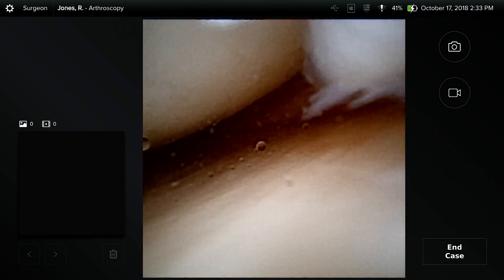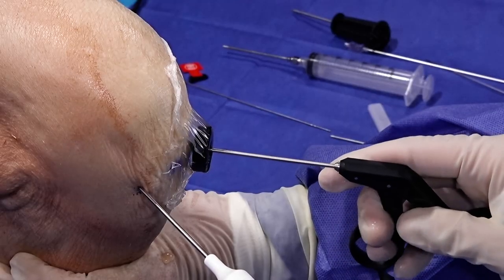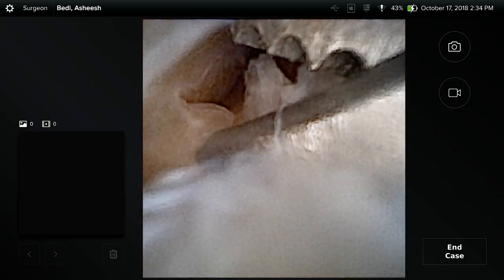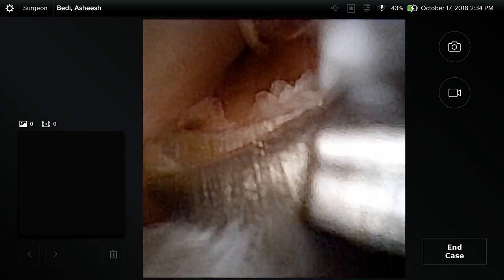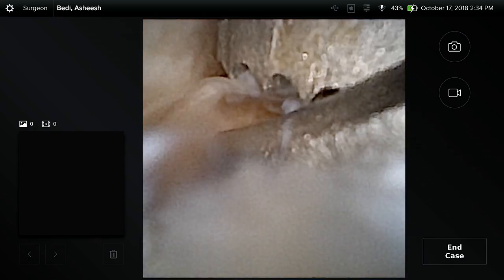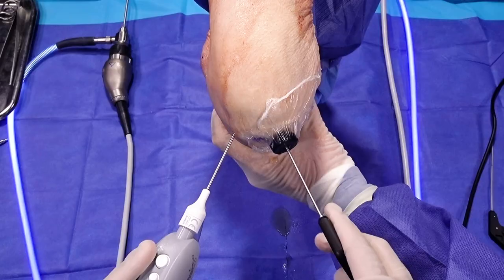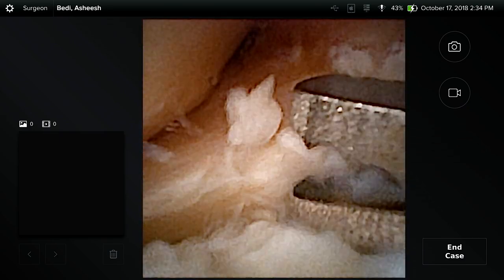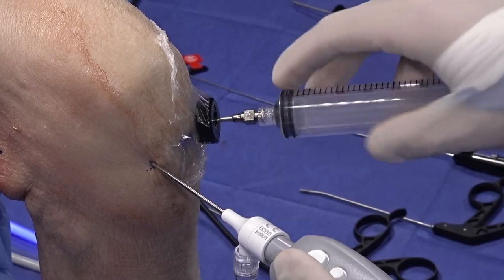Without any valgus we're able to look right over there, and as I now valgus the knee here's our medium straight biter — a small 2 millimeter biter. You can see the posterior horn of our lateral meniscus with incredible clarity. Normally with a standard knee scope I'm not able to see the meniscal root with this clarity. There are very common small oblique parrot beak or small radial tears there, and I'm biting away a portion of that lateral meniscus. We can then use our suction aspiration tool to remove those little meniscus fragments.